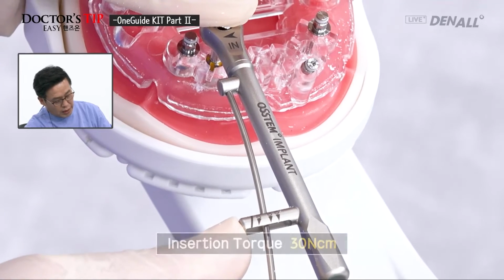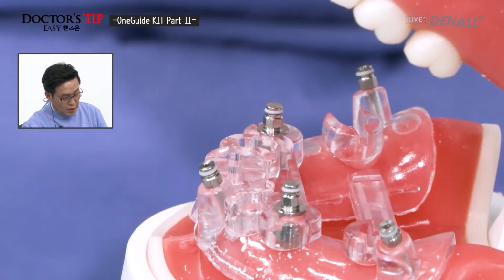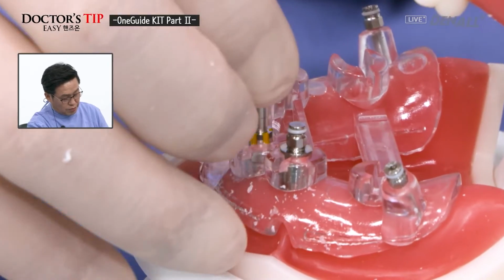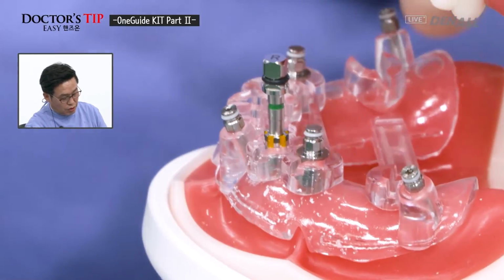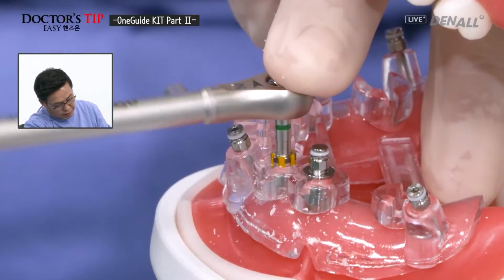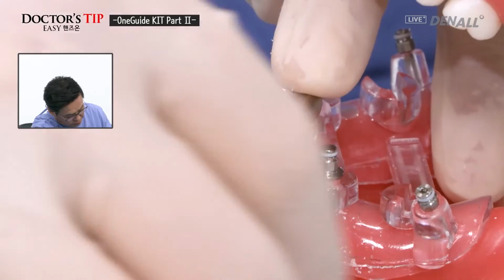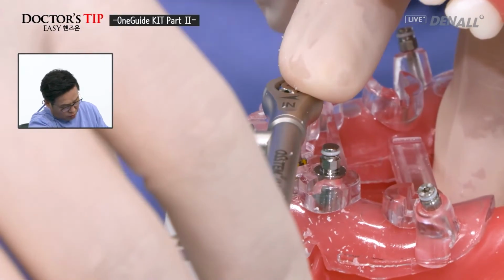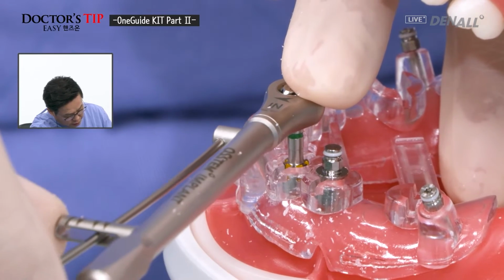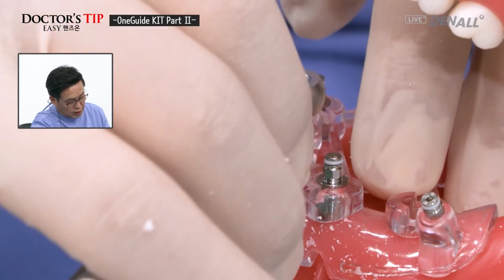Now it's connected. It's approximately 30 Newton centimeters. It's connected. The other side is the same. Connect fixture driver and use hand wrench. Check the final position. The yellow needs to be accurately aligned. There is a guide hole front and back, so 30 Newton centimeter you can see here. Position it accurately and connect it.